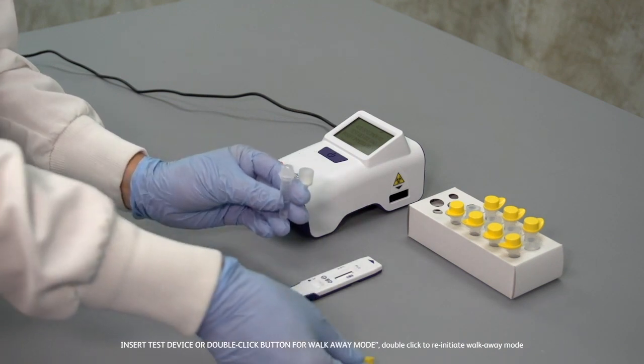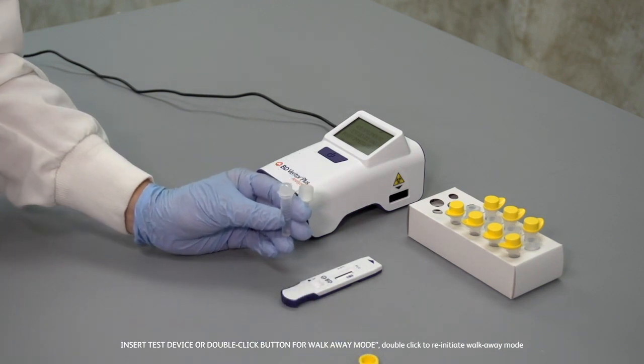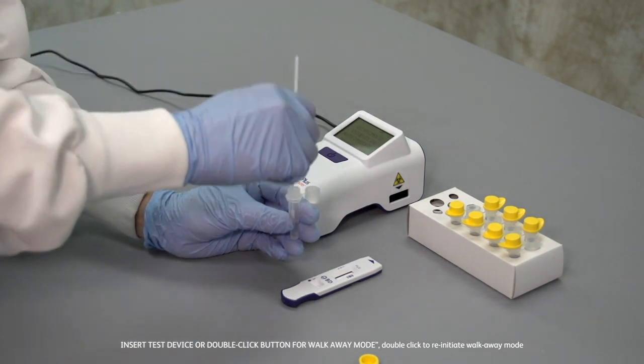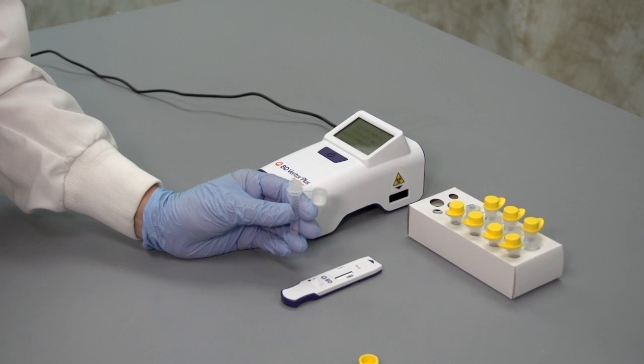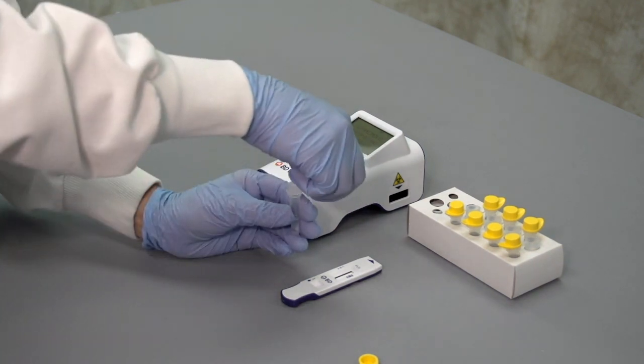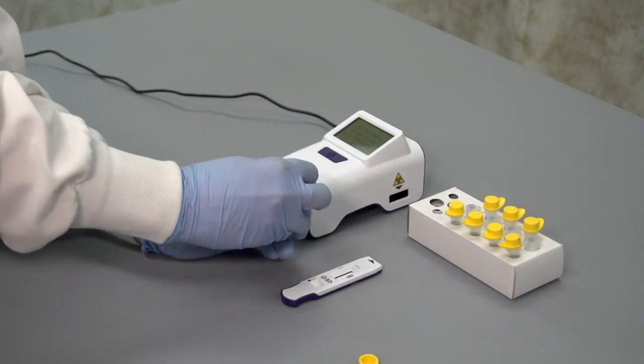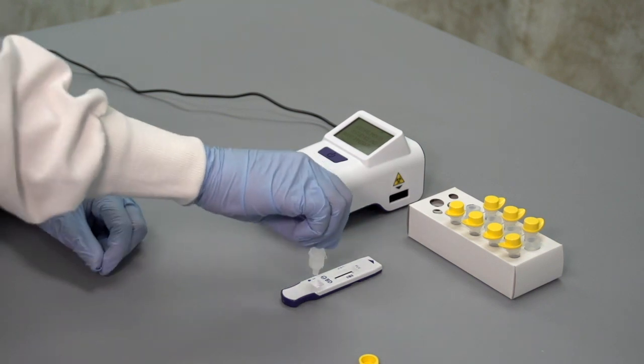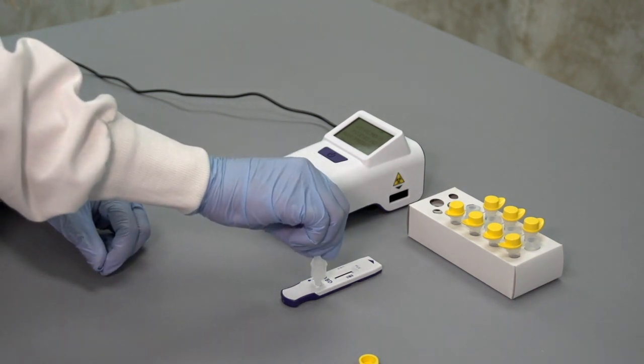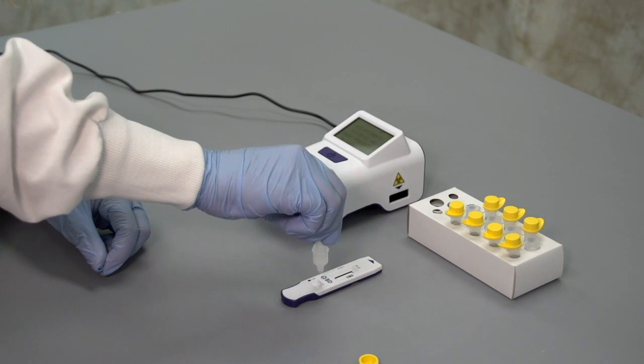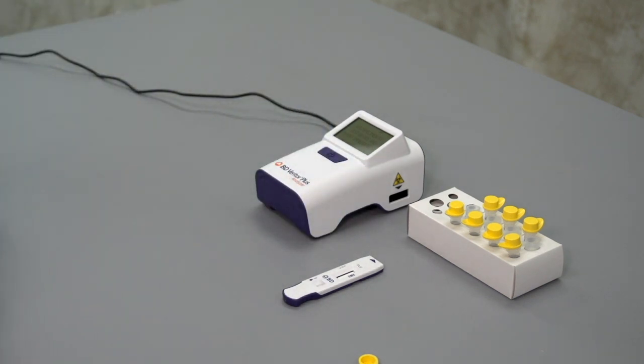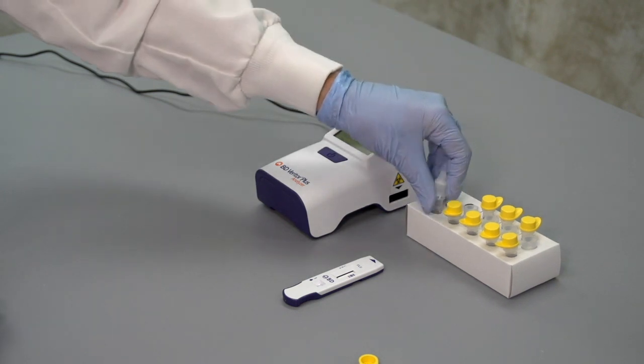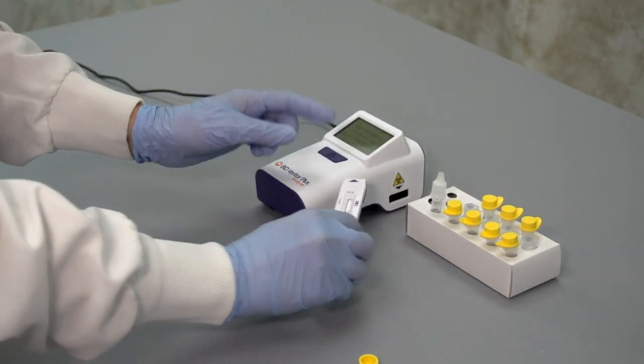A three-minute countdown timer will be displayed on the LCD screen indicating the time available to prepare the patient sample. The test device may be inserted any time during these three minutes. When the sample is prepared, add three drops of the processed patient specimen to the test device sample well and immediately insert the test device fully into the test device slot. A distinct click indicates when the test device is fully inserted.